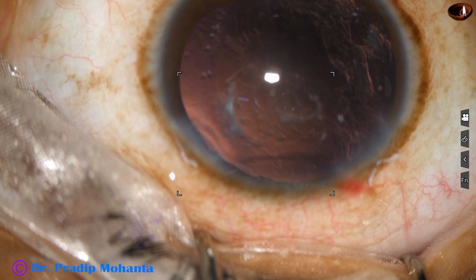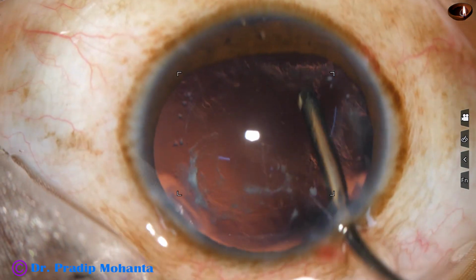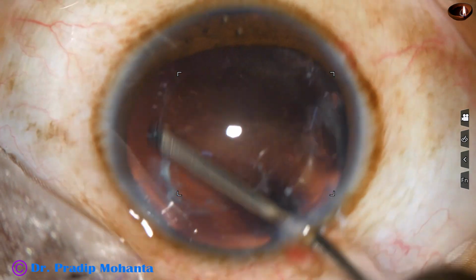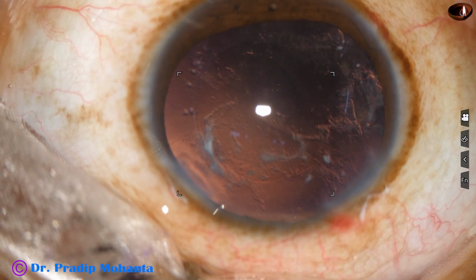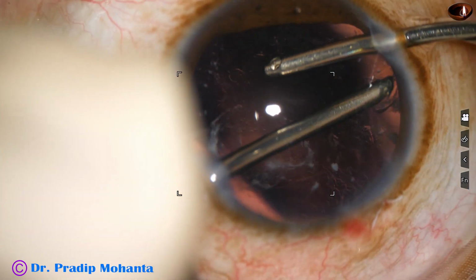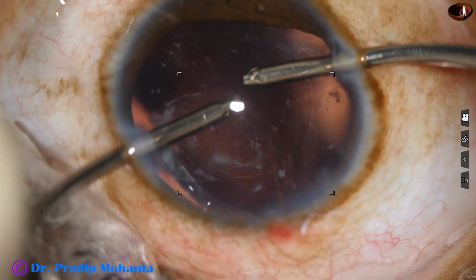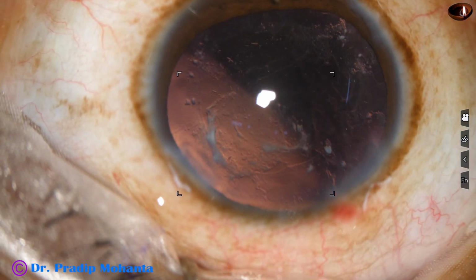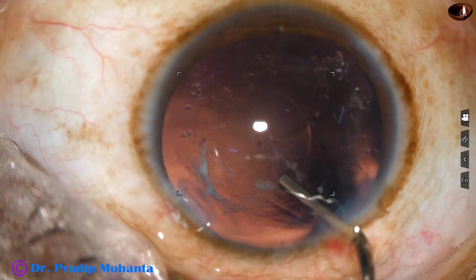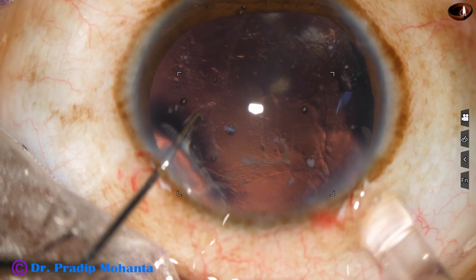And now I ask for the irrigating cannula of bimanual IA. I hydrate the lens matter which is in the periphery, and now I use irrigation aspiration both to remove these loose lens fibers from the periphery. Whenever the lens matter sticks to the posterior capsule, it is a good idea to hydrate it with the irrigating jet of fluid from the irrigating cannula, and when it gets loosened up and gets detached from the posterior capsule, then we can easily remove it with the aspiration cannula.